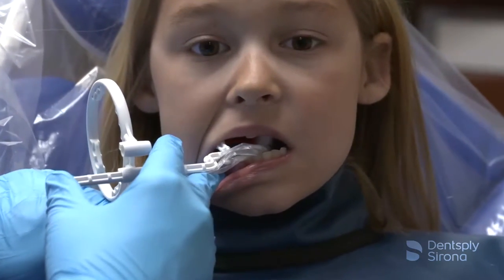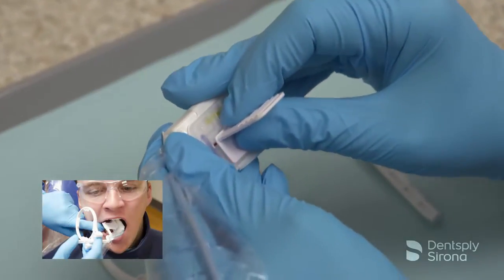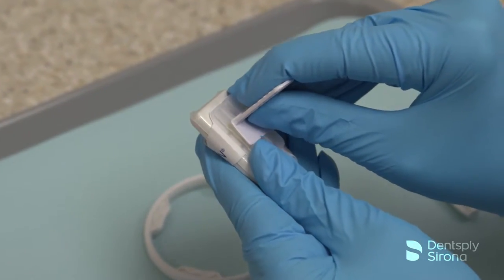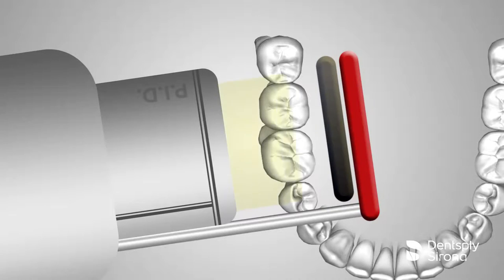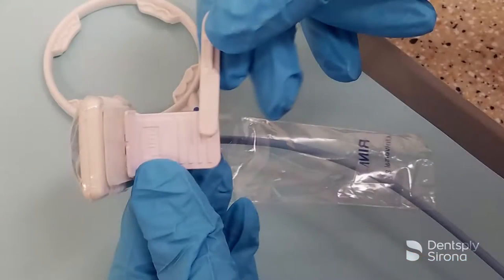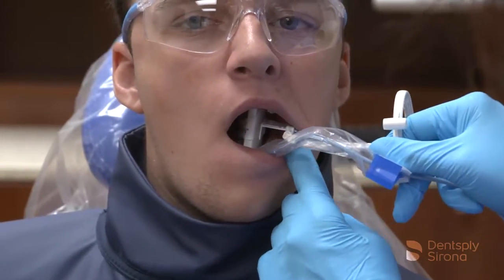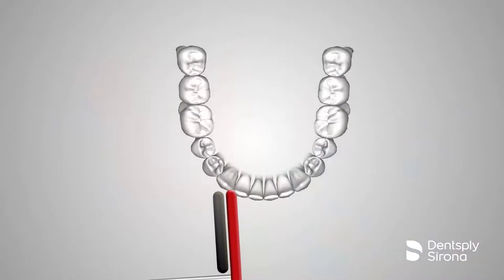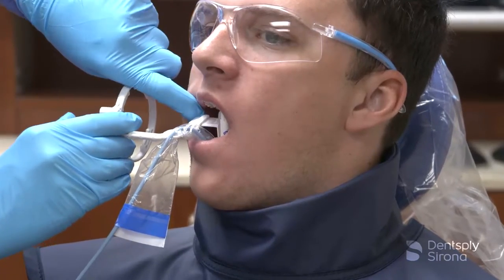On premolar bitewings, center the image receptor behind the second premolar. For horizontal bitewing x-rays, slide the bite piece along the channel to the center of the UniGrip 360 sensor holder base. Turn the bite piece as appropriate for a horizontal or vertical bitewing. To open the contacts and reduce horizontal overlap, the x-ray beam must be parallel to the interproximal spaces and not to the teeth being radiographed. To maximize open contacts for bitewings, attach the UniGrip arm at the end of the bite piece farthest from the sensor. This will ensure the patients don't bite down on the positioning arm. Then position the ring on the red indicator hole, designated for a bitewing image. It is important to ensure that the central ray is perpendicular to the image receptor. On premolar bitewings, center the image receptor behind the second premolar.